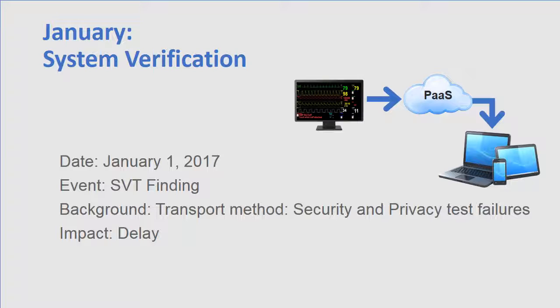We all know how much longer a retrofit takes than a solution designed in from the start. Eventually, the company makes the decision to revert their device software to the previous version, and it builds a PC application which connects the patient monitor to the cloud. The new PC application has fewer regulatory requirements. Its input is the output of the monitor's original software. The PC provides native 128 and 256-bit encryption and plenty of horsepower to cache and de-identify data before uploading it. It is generally a strong solution.